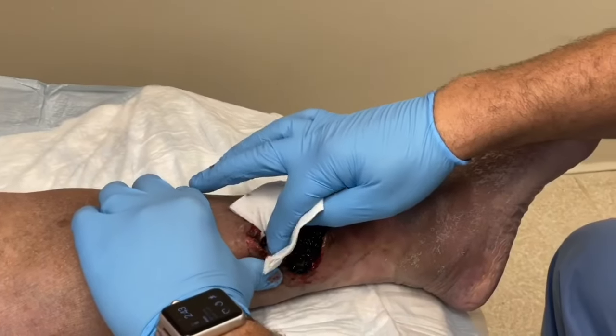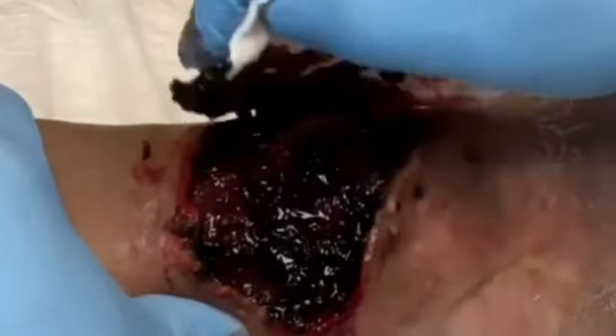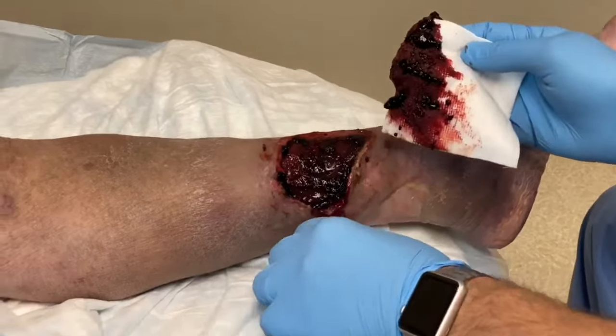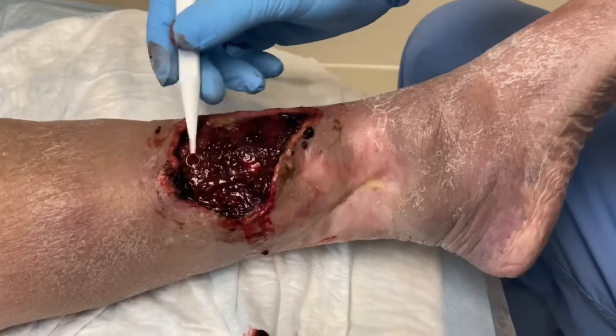As you can see, it has a very characteristic appearance — some people would describe it as a grape jelly-like appearance. It has to be drained or evacuated because if not, it becomes stagnant and a dead space will accumulate under the skin where bacteria can grow and create an infection.